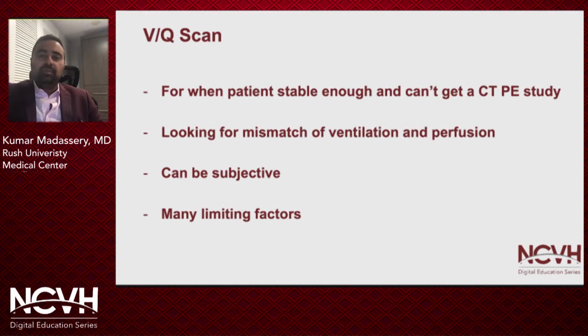The patient has to be able to remain still, and there's a lot of artifacts that can happen. And also there's a lot of subjectivity to when the operator decides to read out the study and say how significant they think the mismatch is. What we're looking at is whether ventilation is preserved in an area where the perfusion is not, which means that there's a high likelihood of PE, and it goes into these categories. Again, a lot of clinical information has to go into this more than just the VQ scan, but it is another modality that many people should be aware of and that it is available, assuming the patient can tolerate it.